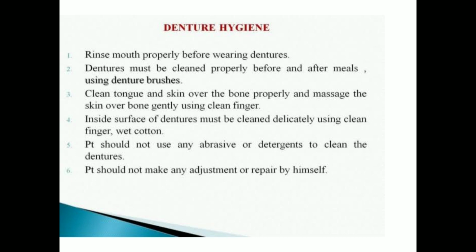And don't use any abrasives. Abrasives means nothing but your toothpaste. You should never use abrasive agents on the teeth, because they may interact with your acrylic teeth and may cause color damage and so on. So all the denture hygiene instructions should be given.